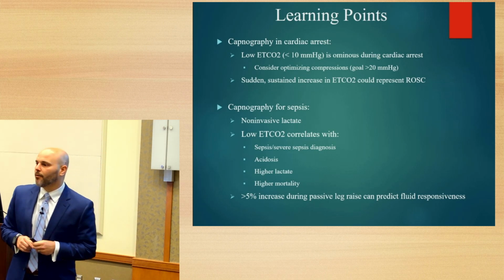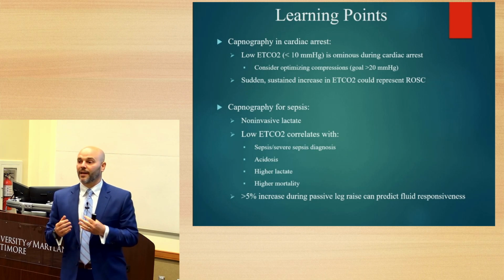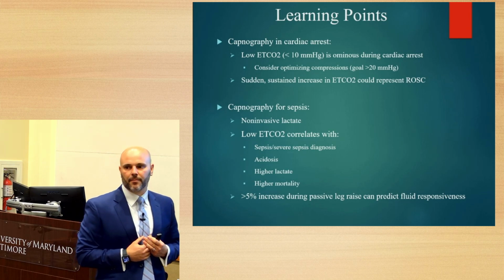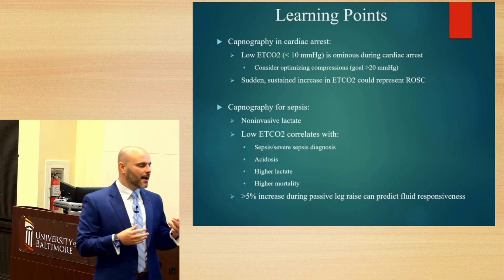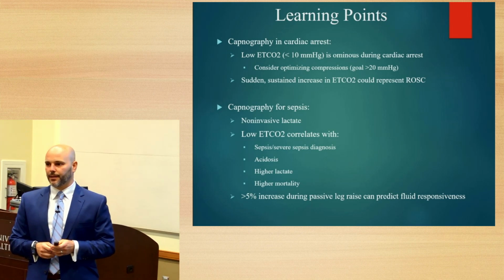Then capnography in cardiac arrest: the information it gives us to help guide the arrest and portend a little bit of mortality as well. And then for sepsis, near and dear to my heart, the ability to diagnose, predict mortality, and help guide the resuscitation through the department and potentially in the ICU.